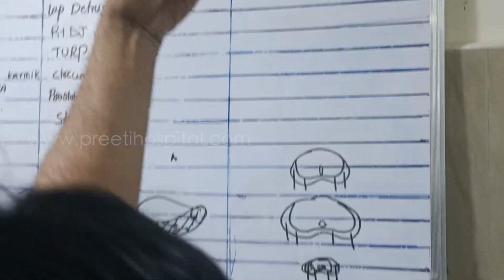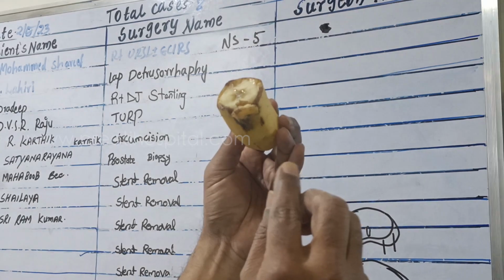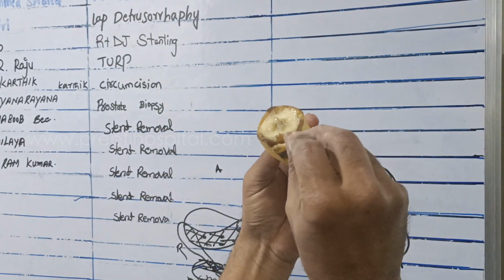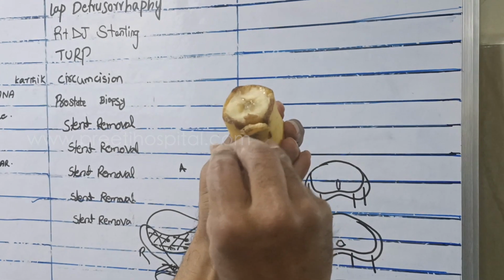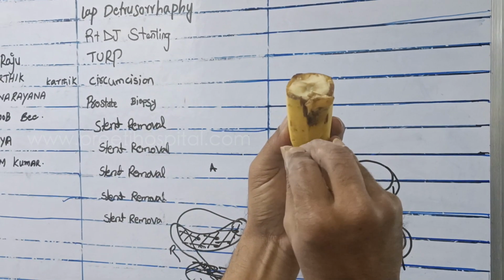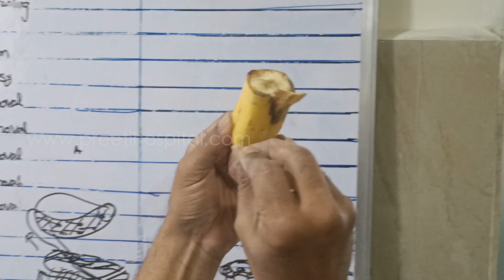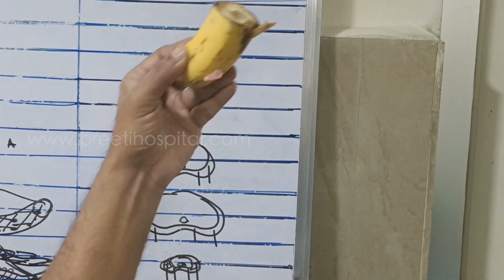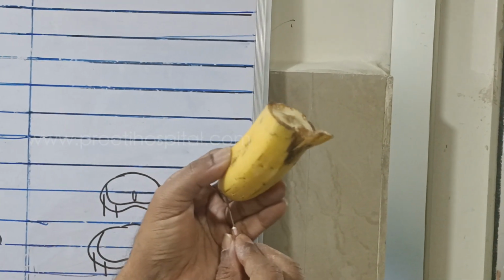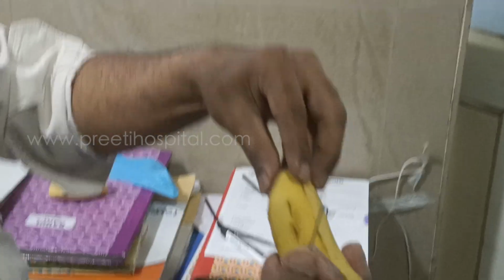But that is not what we wanted to see. We have to see like this. Seminal vesicles will be here. That area you should not come. 1, 2, 1, 2, then 1, 2, 1, 2, then 1, 2, 1, 2. When you are doing like this, see, yellowness has come down. See, yellow is less here. Which is more? This yellow is more. So at the apex region, most of it is yellow.